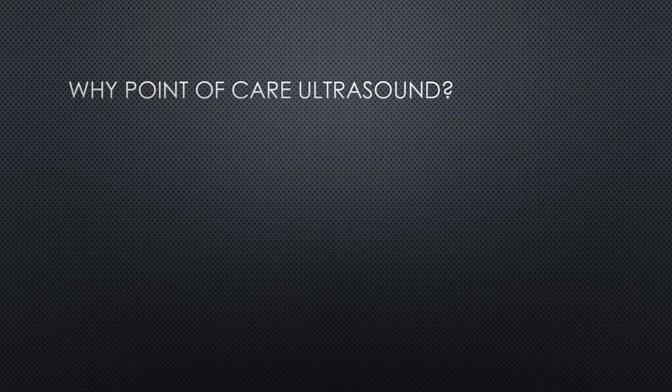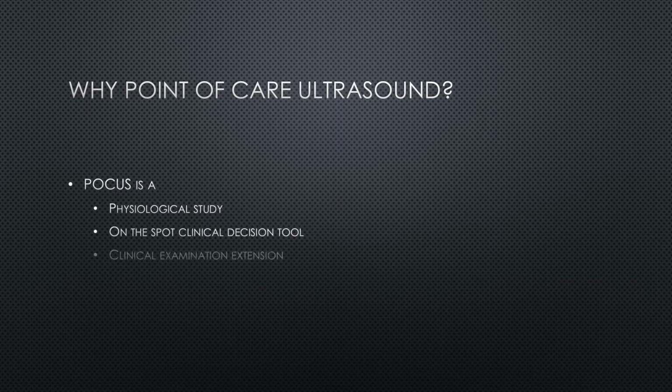So, why point of care ultrasound? There's a bunch of reasons why, but they're really summarized in this really cool acronym that I found earlier on. POCUS is a physiological study, on-the-spot clinical decision tool, clinical examination extension, unique and expanding tool, safe and repeatable. And this sums up really neatly why we use point-of-care ultrasound. It's something that we can take to the patient's bedside that makes a difference in their care, and that we can do over and over again if the patient changes or deteriorates, and it's safe, and it's easy to teach and very approachable.